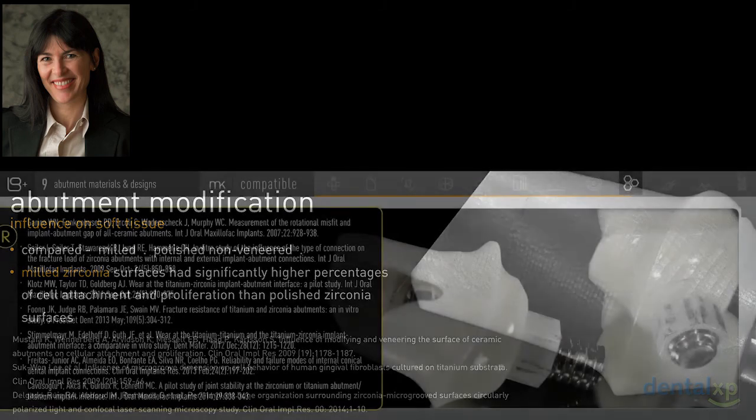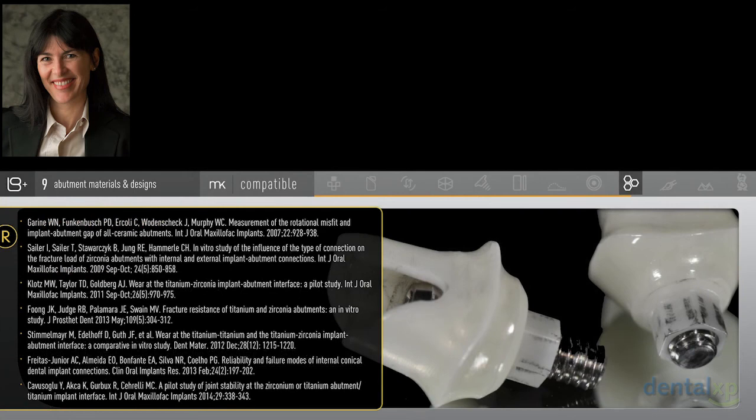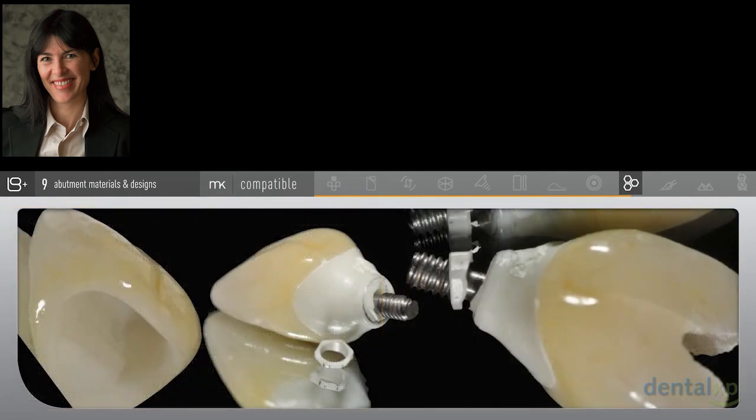So we think about how we're handling it. And we also today, and unfortunately this has come through learning through problems, we started looking at that abutment design here, which is routine in our practice for so many years, and we're looking at the little gray areas on the head of the implant. We realized that that's titanium wearing off from the inner part of the implant to the head of the implant on the zirconia abutment, and wasn't so worried about that until eventually we started looking at problems that were occurring, and that is abutment fracturing.